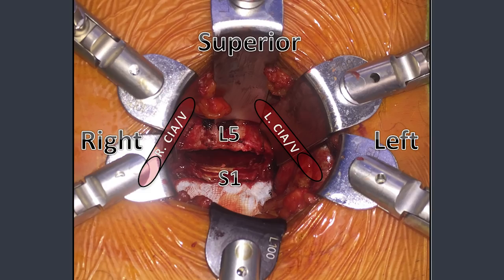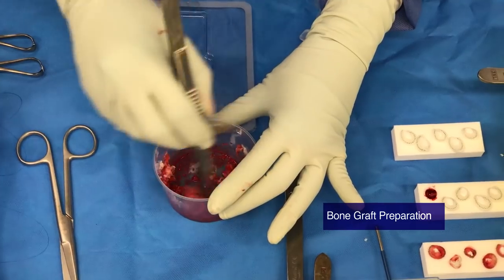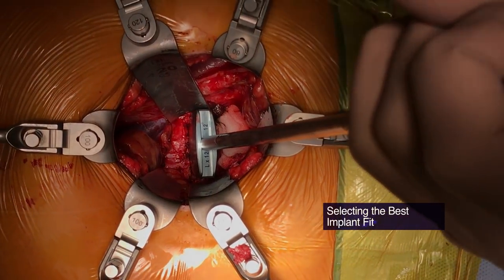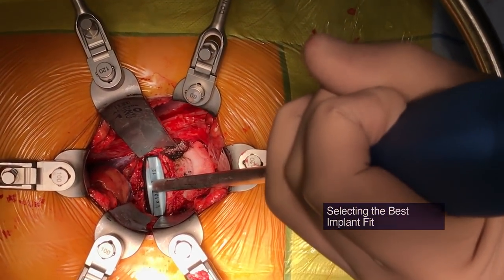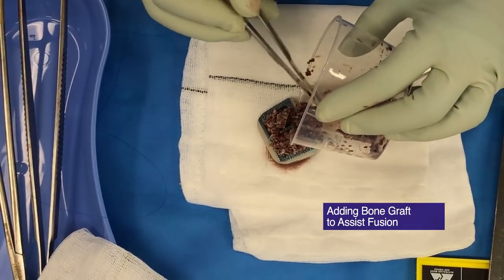This figure reveals the position of the iliac vessels in relation to the disc space. The bone graft is prepared on the back table — in this case allograft and BMP. A trial prosthesis is inserted, and an x-ray is performed to confirm depth, position, and lordosis. The appropriate implant is chosen and packed with bone graft ready for implantation.